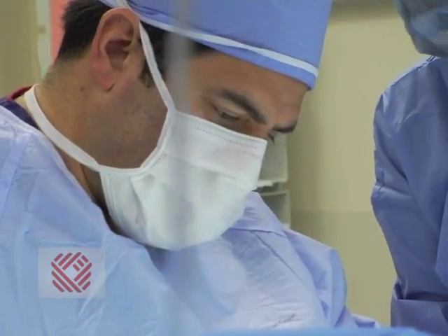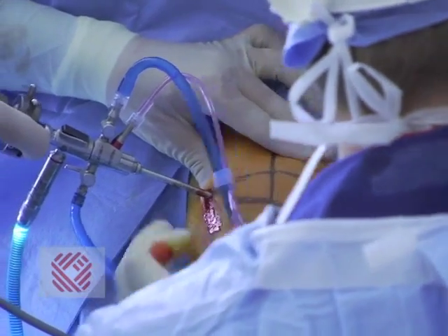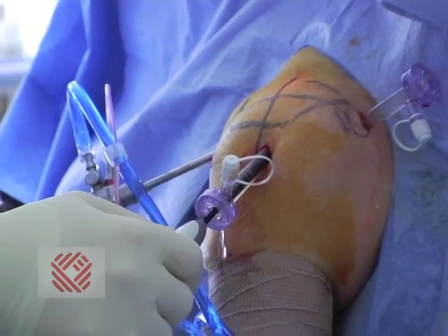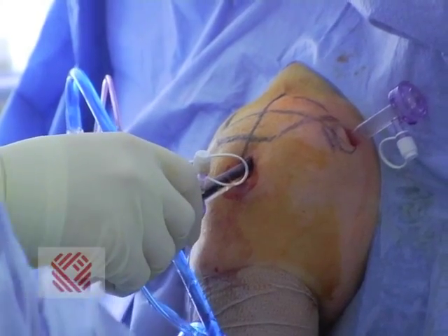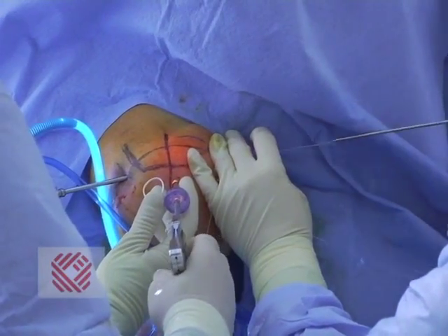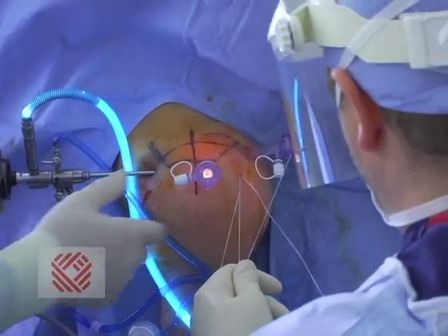The arthroscope is a small camera that can be inserted into the shoulder through tiny incisions of less than one centimeter. Maybe 10 to 15 years ago, the treatment for a rotator cuff tear involved making a large incision over the side or front of the shoulder, and the surgeon would have to peel off the deltoid muscle to get down to the cuff. That has all changed now. The cuff can be repaired through tiny poke holes using this small camera called an arthroscope, which has really cut down on the amount of pain and stiffness postoperatively. Patients get back to their daily lives much, much quicker than they did with an open cuff repair.